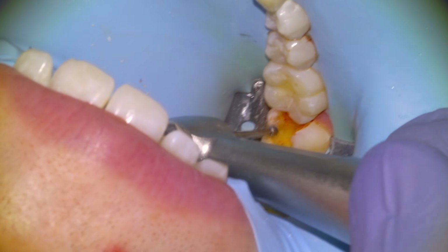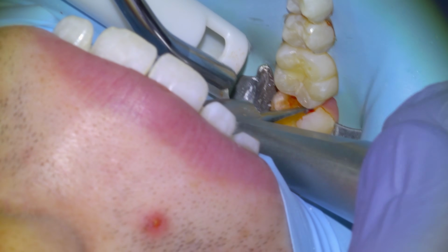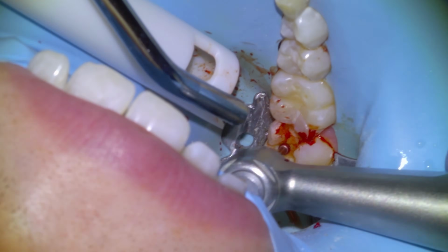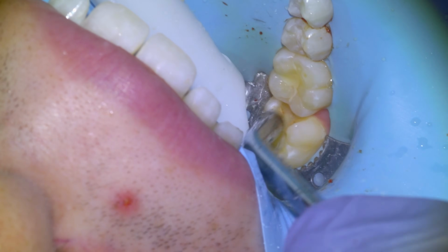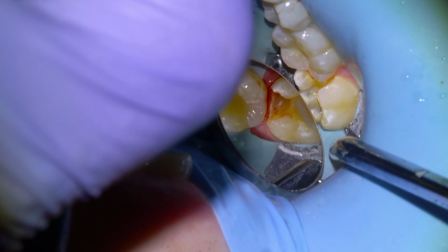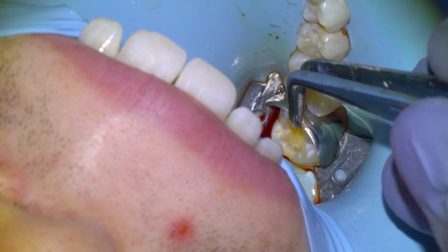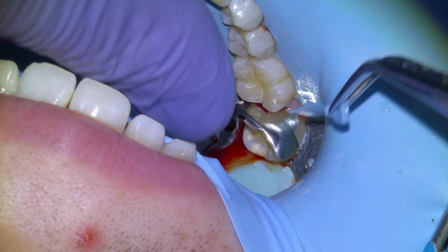So we're almost ready to go, just a little bit more caries reduction. Can use a little bit of a bigger burr to make sure that there aren't any sharp internal line angles. Going to get that lingual aspect of the caries, and then we're pretty much going to be ready to go. This was a bit of a deeper lesion. You could have seen on the x-ray the patient actually did complain of sweet sensitivity. So we're ready to restore there. Happy with the hardness of the tooth to the instrument.